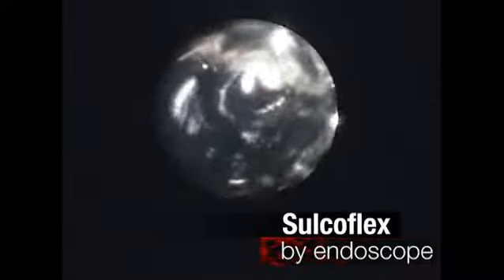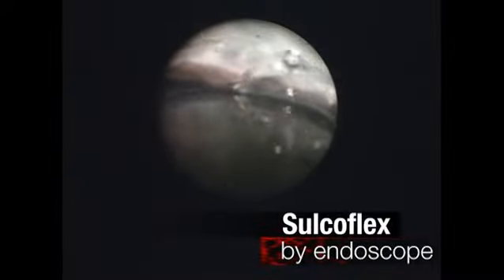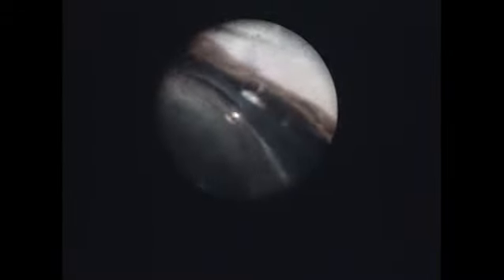Sulcoflex. The Sulcoflex IOL, upon being injected, finds less space to unfold since the capsular bag is already occupied by another lens. The IOL is rotated until the haptic loops, with their undulated design, are positioned in the sulcus. Whereas from behind we observe the single-piece IOL in the capsular bag, from above we see the finer haptic loops of the Sulcoflex positioned on the sulcus. The folds of the haptic loop remain in contact with the sulcus along practically its entire length.